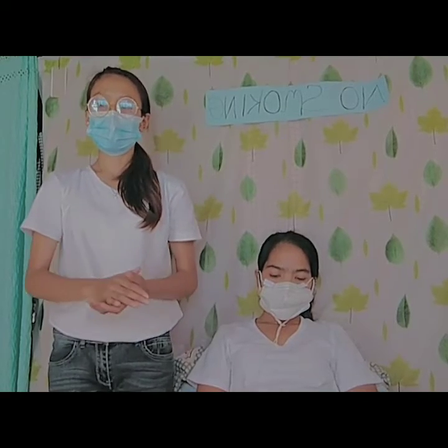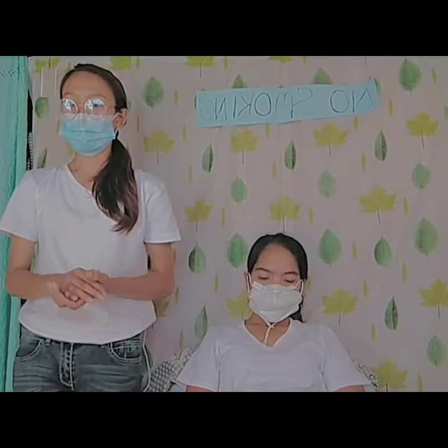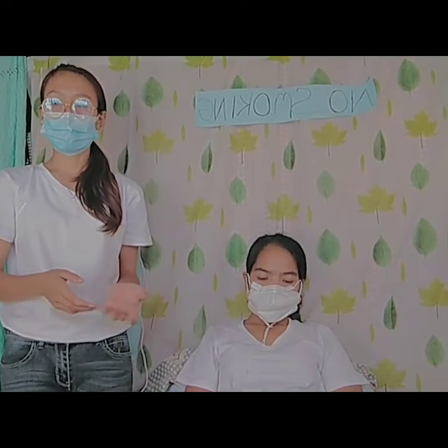Then we're going to monitor continuous therapy by checking the pressure areas on the skin and nares every 2 hours, and checking the flow rate every 4 to 8 hours. Then we are going to document the response to the oxygen therapy or the nasal cannula therapy.